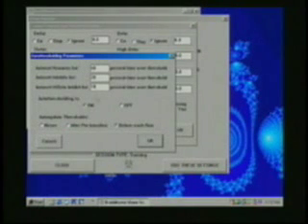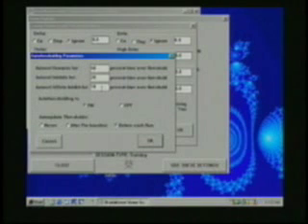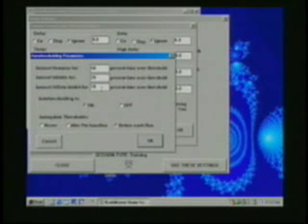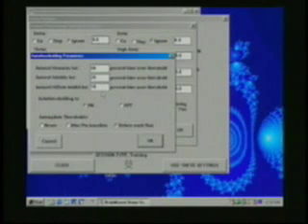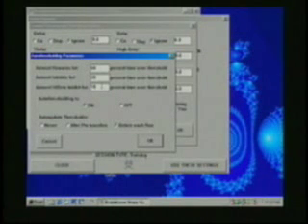There's a separate inhibit percent for high beta. And that's typically set at a much lower value because we're not really trying to down train it just to keep it from getting too large. And in this case it's 10 percent.